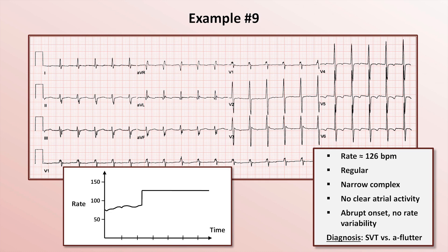The overall ventricular rate is unusual for both of those possibilities, but there really isn't any other explanation. There is absolutely nothing to suggest flutter waves in the inferior leads or V1, and the tiny R' waveform seen in V3 could be a P-wave tacked onto the back of a QRS — both more suggestive of SVT.